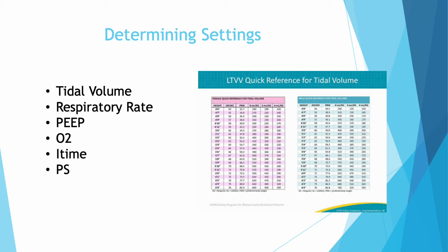So a patient with a long I time that's spontaneously breathing may not like the long I time, and they want shallow or smaller I times, which would create faster flow into the patient. Patients that are not spontaneously breathing usually benefit from I time in the fact that you're doing small breath holds from breath to breath to breath, and it helps recruit alveoli, just like PEEP does.